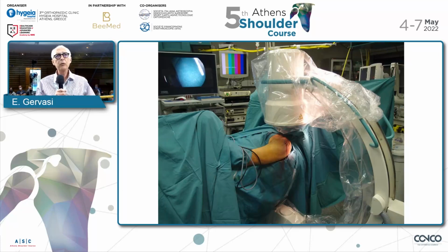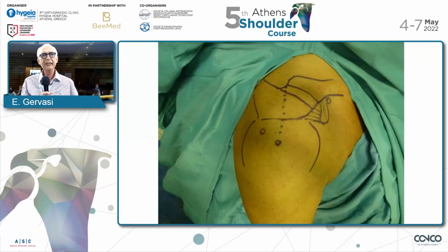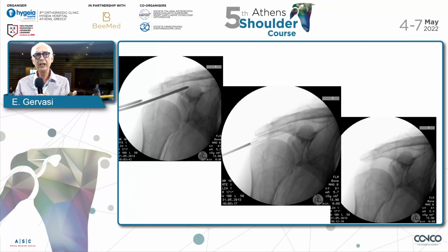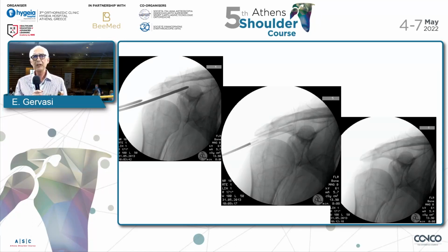You set the fluoroscopy, so you don't have to do arthroscopy. Most orthopedic surgeons are trained to use a fluoroscope and the rods, as in these pictures. In the first one at the left, I enter with a rod into the subacromial space and check by fluoroscopy. Then I put a similar length rod to measure the size of the balloon. In the central one, I put the balloon in, and the last one shows the recentered head.